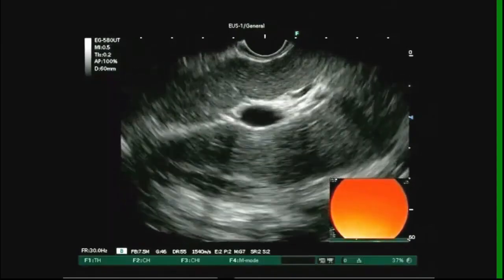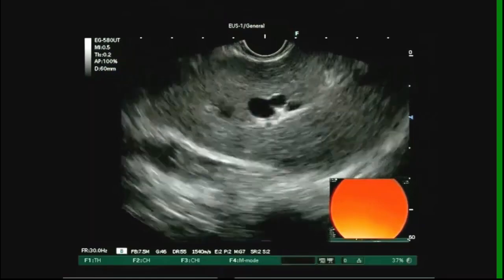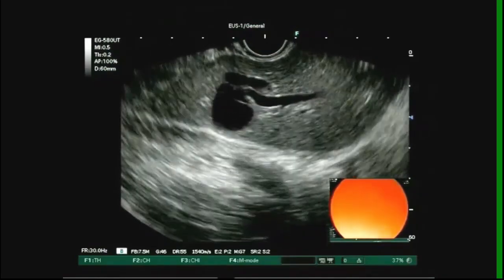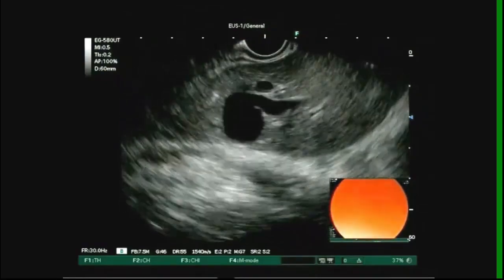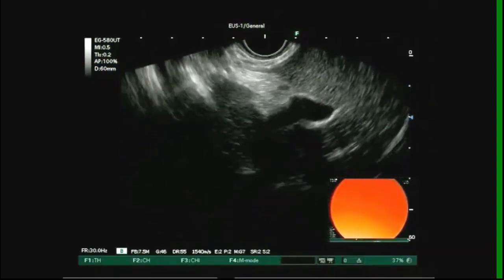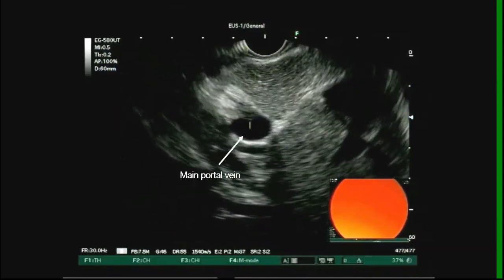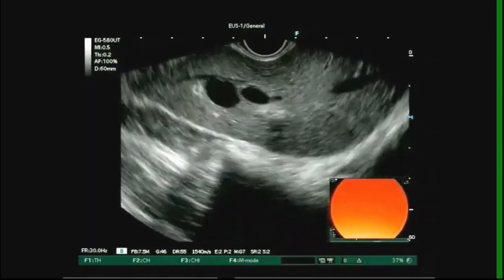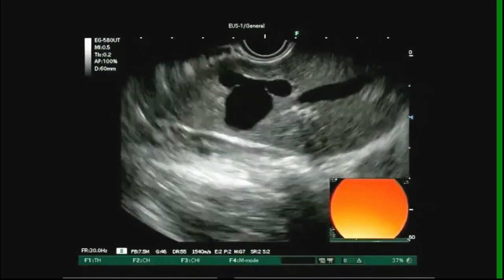Here you see the left branch of the portal vein. The left branch of portal vein is seen to enter the main portal vein by clockwise rotation of the scope. Now the blood flow is observed in the aneurysmal communicating vessel.